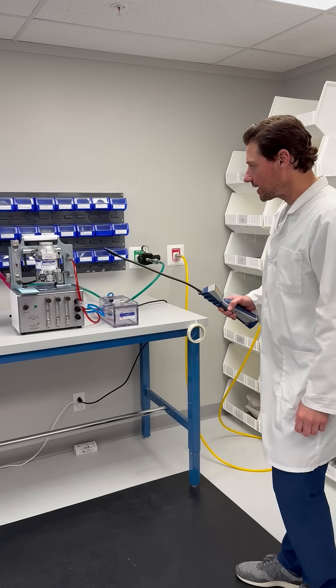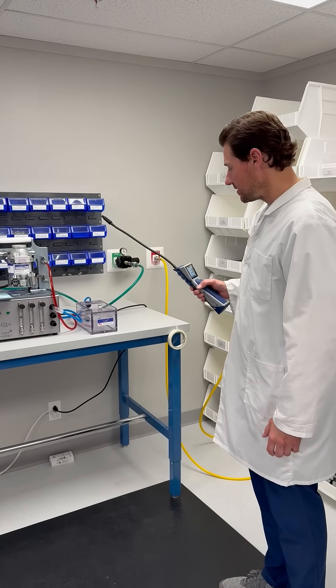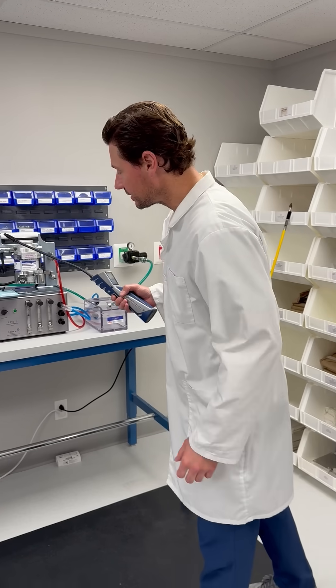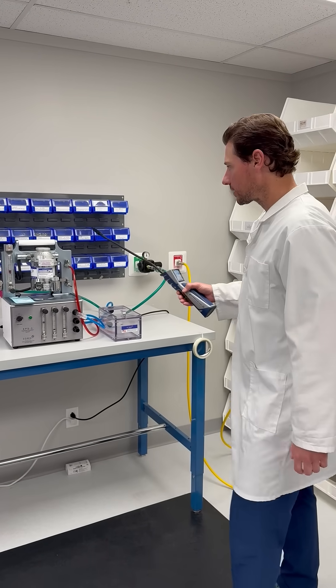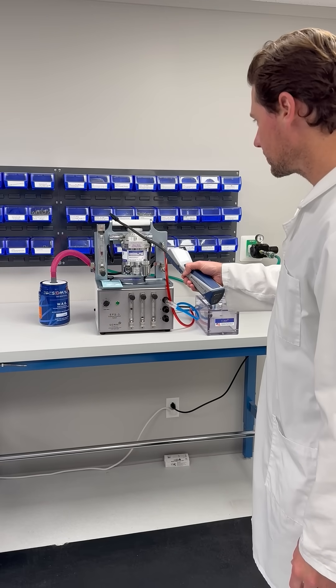After 10 minutes, we'll come back and observe the area and equipment using a D-TEC leak detector. We'll check each of the devices for any waste gas exposure.